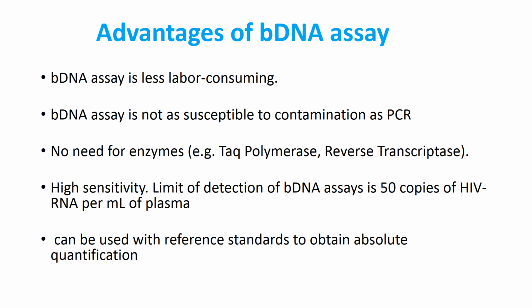The second advantage is this assay is not as susceptible to contamination as PCR because it's a signal amplification method, not a target amplification method like PCR that will replicate contaminated DNA or RNA. The third advantage is this assay has no need for enzyme like Taq polymerase, which means no false negative results due to potential inhibitors to enzymes.